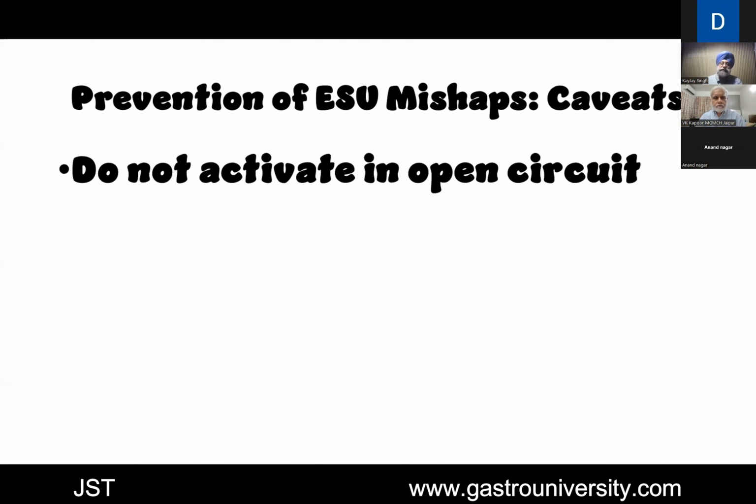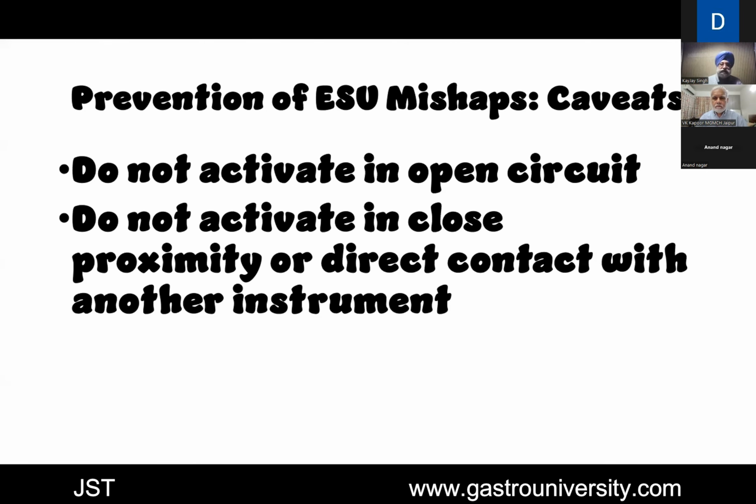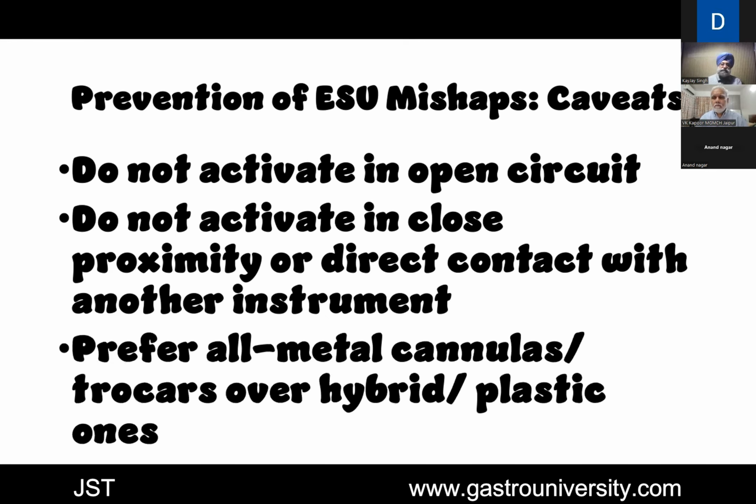Do not activate in open circuit. Open circuit means when the active electrode is outside of the body. Do not activate because the long circuit is there and stray currents are definitely going to damage the patient somewhere. Do not activate in close proximity or direct contact with another instrument. As I said, 2 centimeters is the distance. Prefer all metal cannulas or trocars over hybrid or plastic ones.